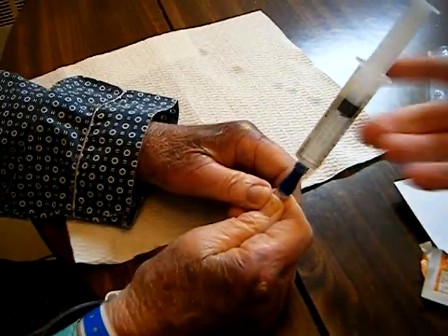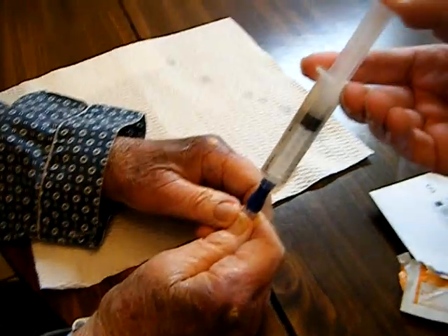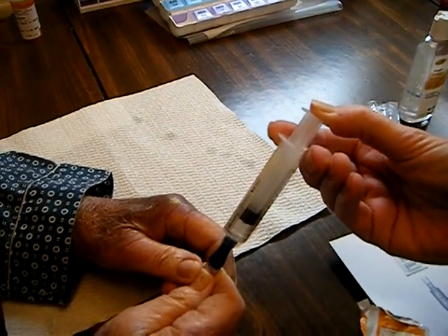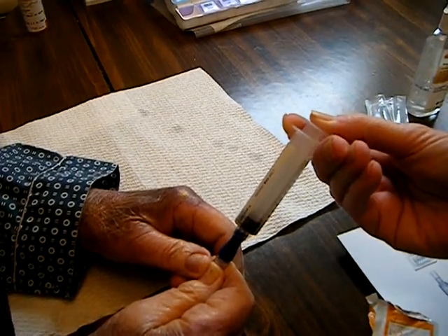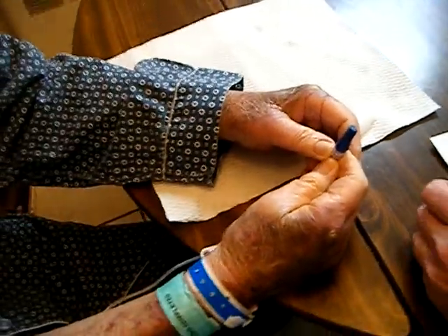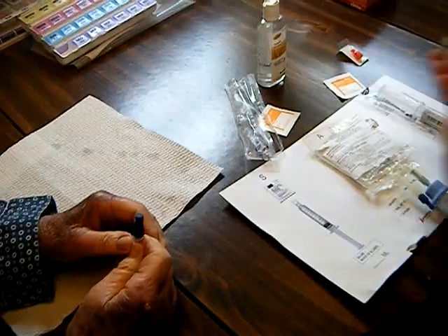At this point, with your two fingers and your thumb, not too fast, not too slow — see the speed I'm going? Just fast enough to flush out any remnants of debris that might be in the line from the previous treatment. At this point we unscrew. This goes in the garbage.